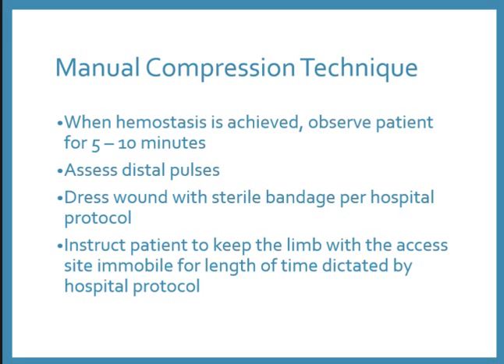When your hemostasis is achieved, you should monitor the patient for another 5 to 10 minutes. Just sit there, talk with them, put your line in the trash, whatever it is you've got to do. You're going to assess their distal pulses, look at their feet. Is it cool? Is it purple? What does it look like? Dress the wound with a sterile bandage per our protocol, which you can use a Tegaderm and a 4x4. You can use a Tegaderm and a biopatch. Just make sure that it is sterile. Just like when you pull it, you should be wearing sterile gloves.